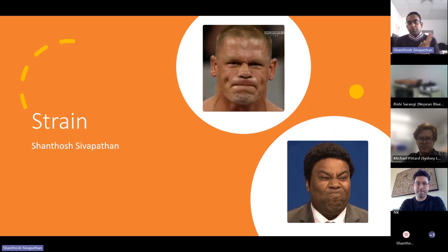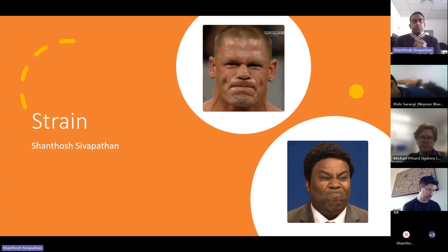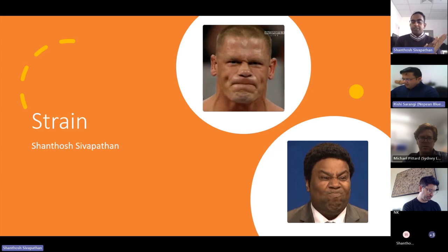All right, so I'm going to talk to you about strain or speckle tracking echocardiography. I'm not sure how much of that will be covered or used in your DDU exams, but Sam asked me to present this.